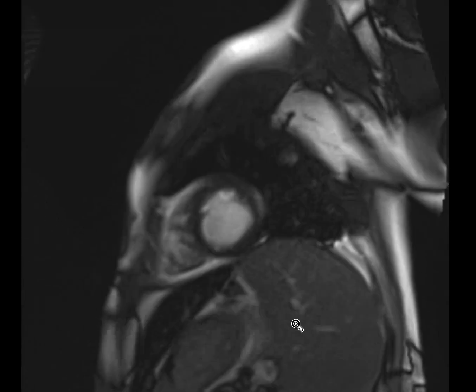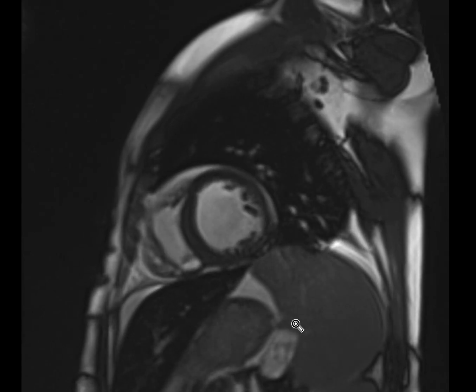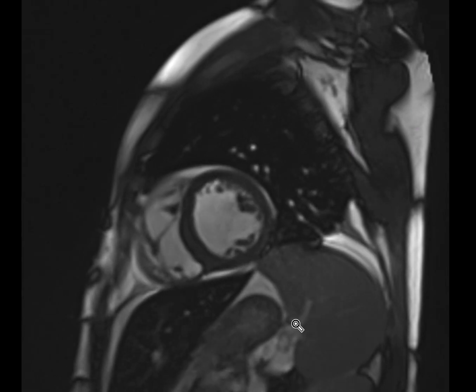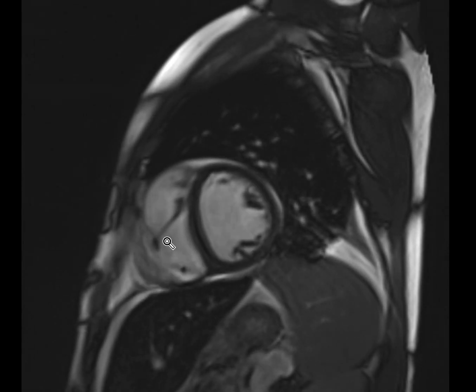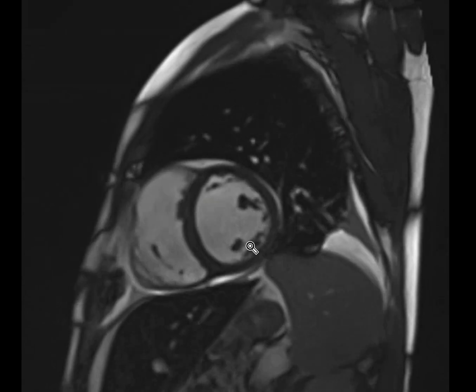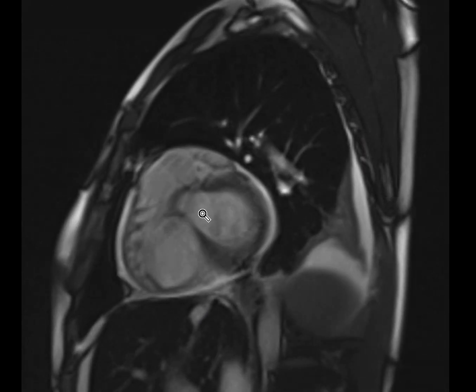On the short axis view we can see poor radial systolic function. The kinesis of the myocardium is globally severely hypokinetic with no regional wall motion abnormality, which confirms again there is no territorial coronary artery disease. There was no excessive trabeculation, myocardium was not thickened so there was no significant hypertrophy on either the right or left side, and the LVOT was unobstructed.